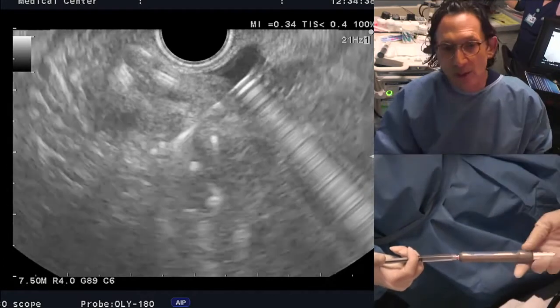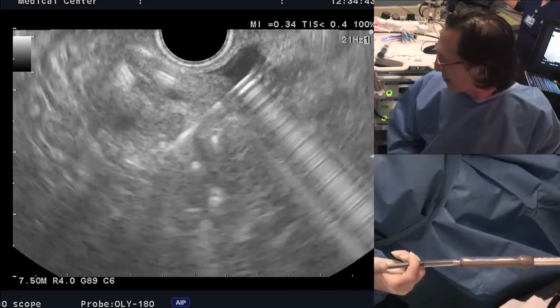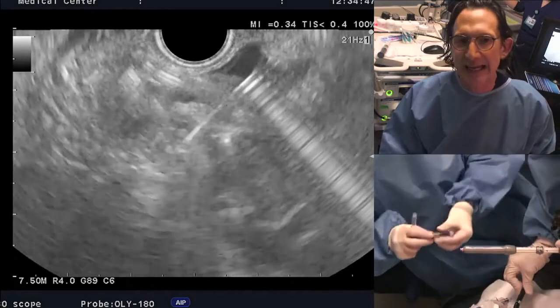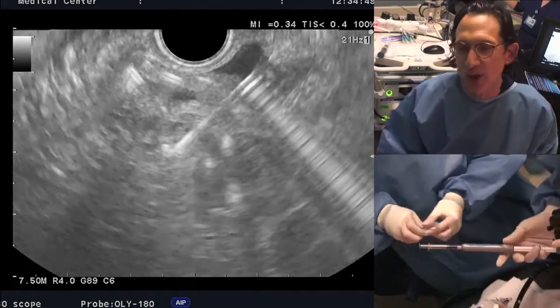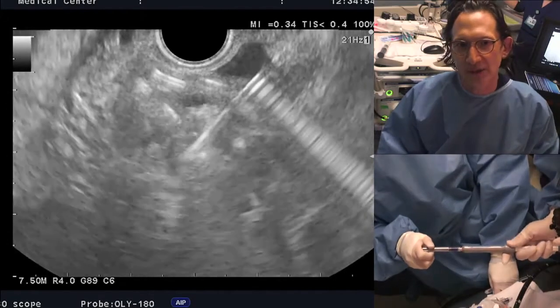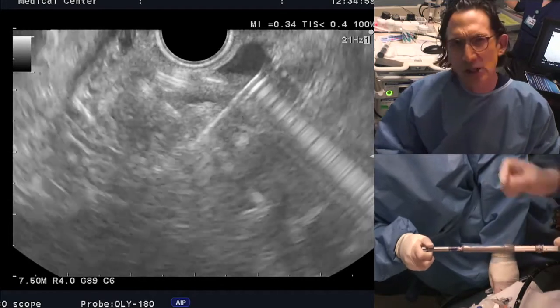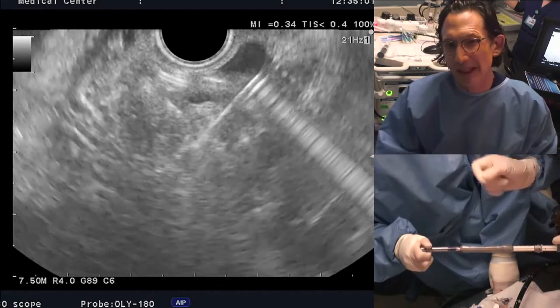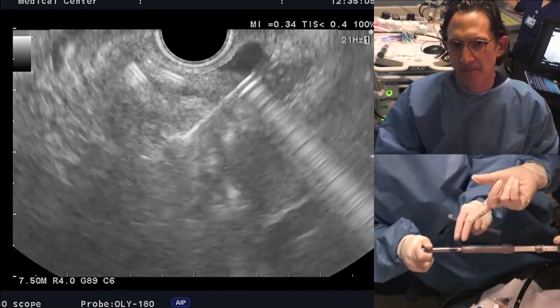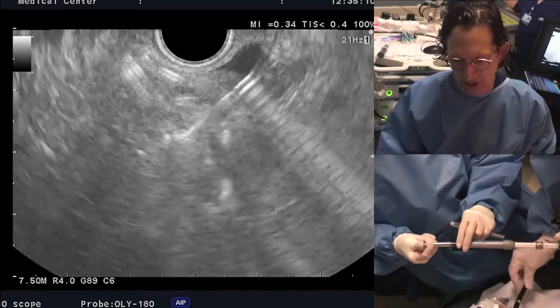All right, so I'm going to remove now. No. Okay. I've given three. Three, yes. Do you want a fourth? Go ahead and give a fourth. I'm putting a lot of glue in today because these are so big. We usually don't. Usually it's one coil, one glue. But I'm going to just fill this up with a fourth. These are aliquots of about 0.5 cc's, and in total, it's maybe about 2 cc's that goes in.